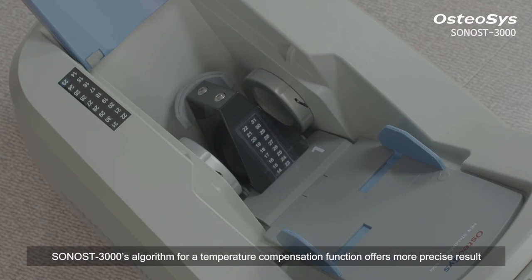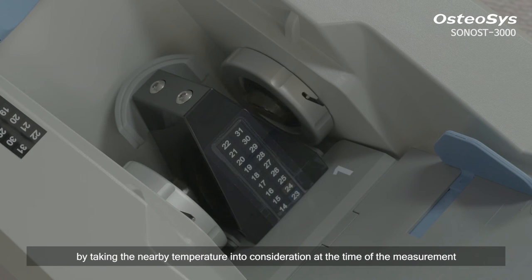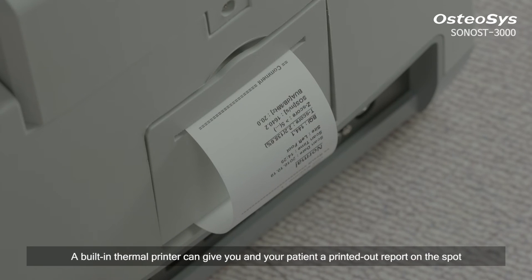SONOST-3000's algorithm for a temperature compensation function offers more precise results by taking the nearby temperature into consideration at the time of the measurement. A built-in thermal printer can give you and your patient a printed-out report on the spot.